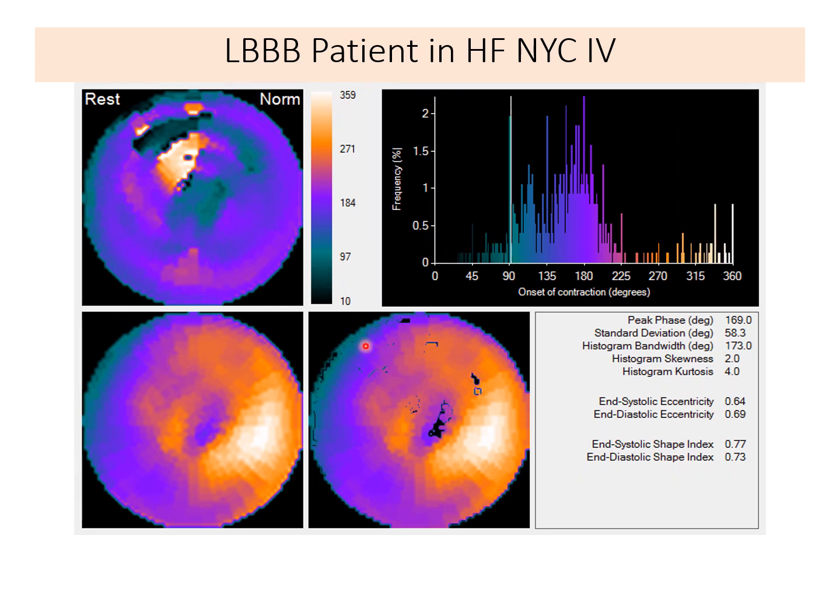But as you see the onset of contraction, you can see either with your eye in the polar map that this is the last region to contract, this being the very last one, but it moves through here. If you look at it with your eyes, you would again see that if we start again, as it goes through, it goes like that and it finishes here. So I will go one more time around to see that this is where it's going to end up in terms of the onset of mechanical contraction.